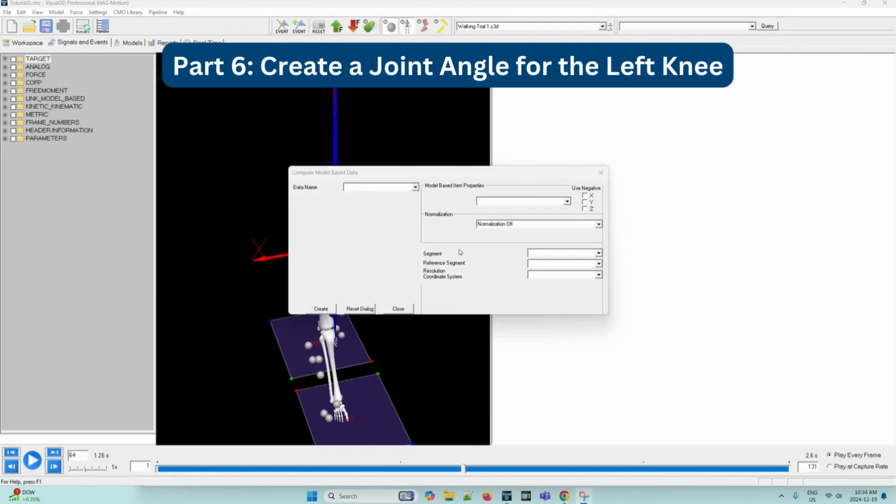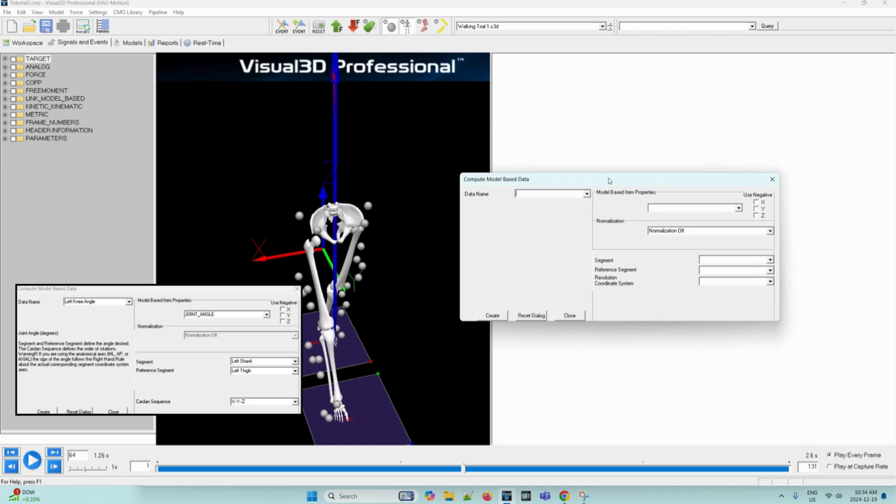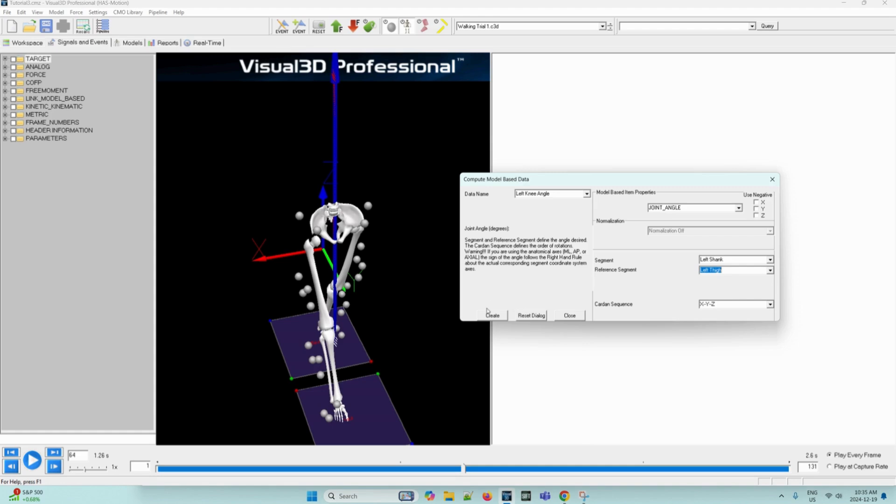Now in the same dialog box, we will be creating the joint angle for the left knee. We can enter the information seen in the image displayed. This will be the corresponding left side parameters to the previously created right knee angle. In the data name box, we can fill it out as left knee angle. And in the model based item properties box, we can select joint angle from the drop down. We can leave the normalization as off. And then the segment will be left shank. And then the reference segment will be left thigh. The Cardan sequence can stay as XYZ. And then we can select Create.